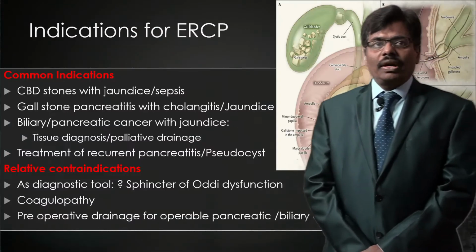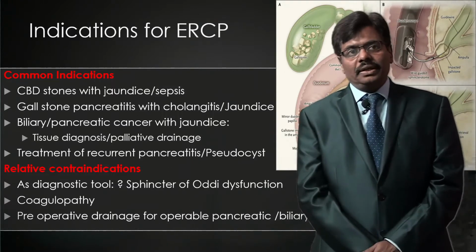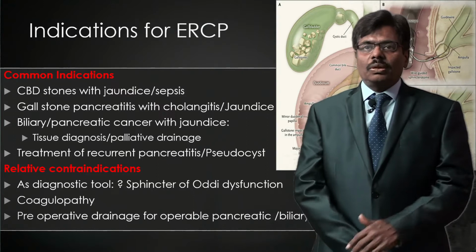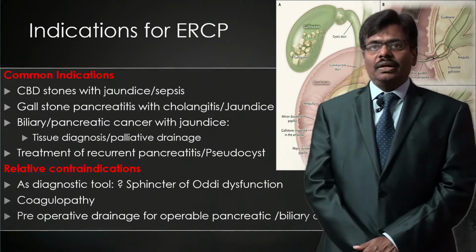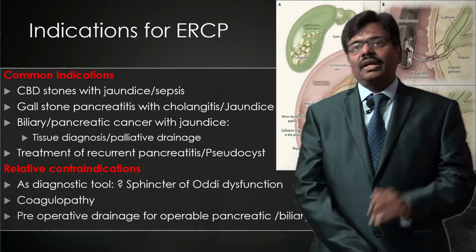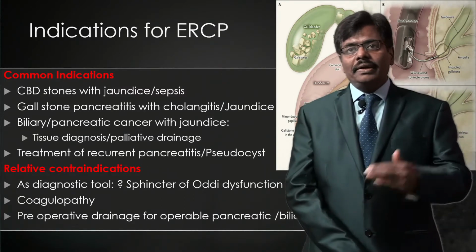We need to know, for example, whether the patient is coming in for ERCP for the right indication, because you can't take this procedure lightly. There should be a definite benefit, a therapeutic intention for you to do the ERCP. ERCP is no longer a diagnostic modality. If somebody has a biliopancreatic problem that needs to be addressed by diagnosis, we have MRCP, US, CT contrast. So better we confine ourselves to a definite indication like a CBD stone with jaundice, or gallstone pancreatitis with persisting stone in the bile duct, or increasing jaundice or sepsis.